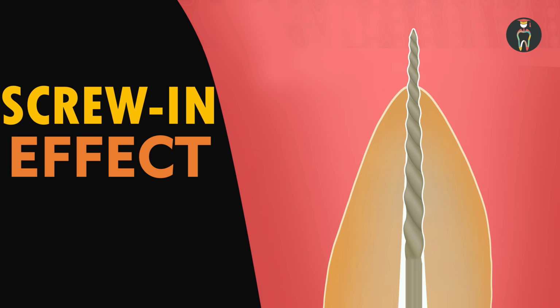I hope that if you follow this technique, and if you have ever experienced the screw-in effect, these techniques and this understanding about file selection will help you perform root canal treatment better without causing much apical violation. If it has happened maybe once or twice, continue and master your technique. If it is happening frequently, then you may have to consider changing the file type, or shift to a reciprocation file type of canal preparation for a few months, and then after getting a better hand and better understanding, you can move on.